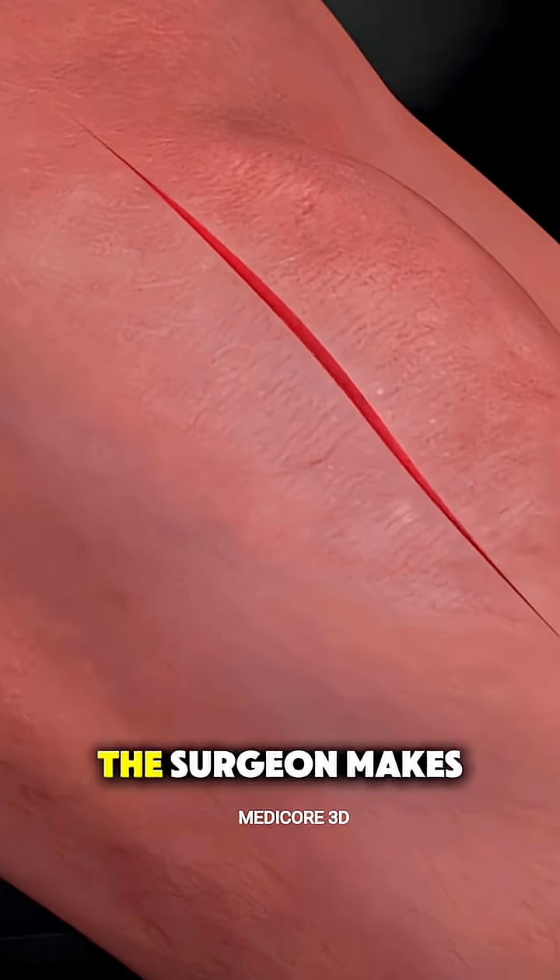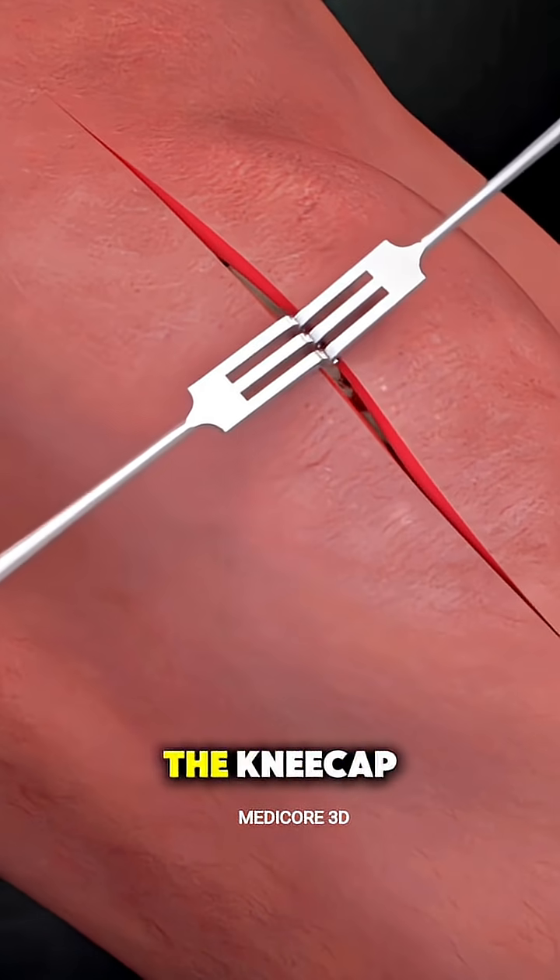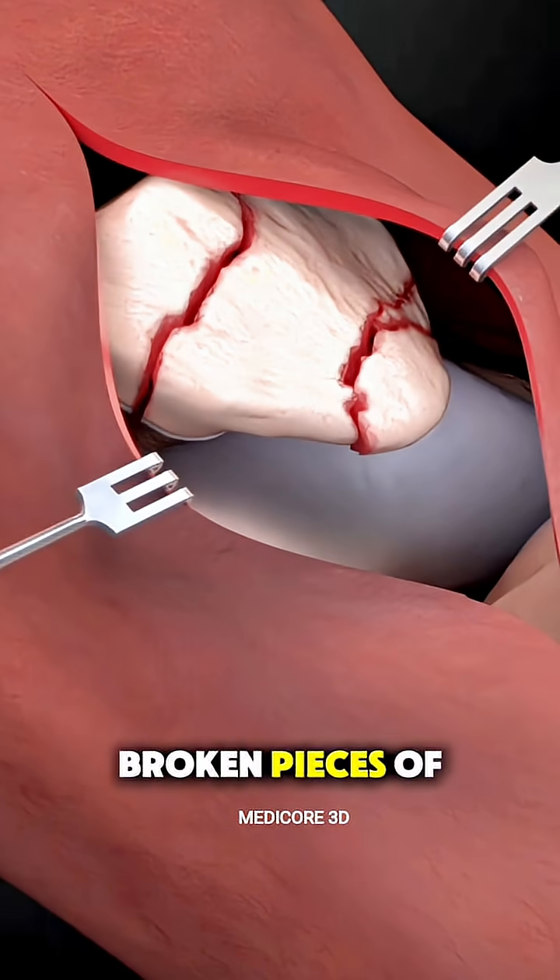Once you're prepped, the surgeon makes an incision over the kneecap to access the broken pieces of the patella.